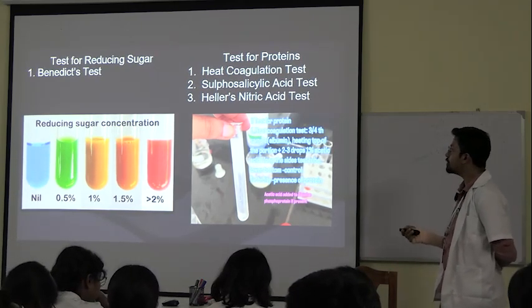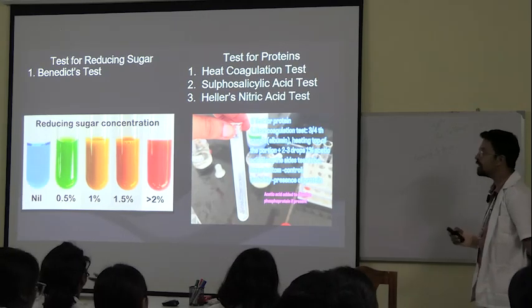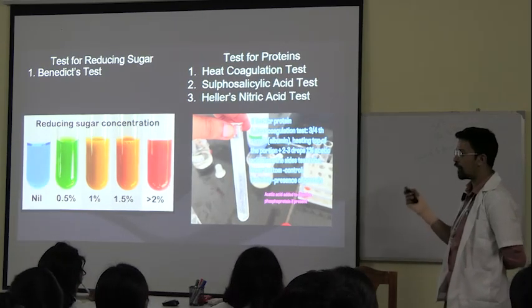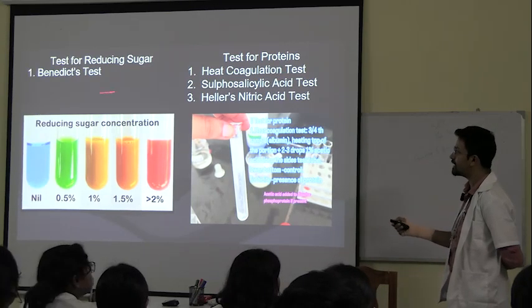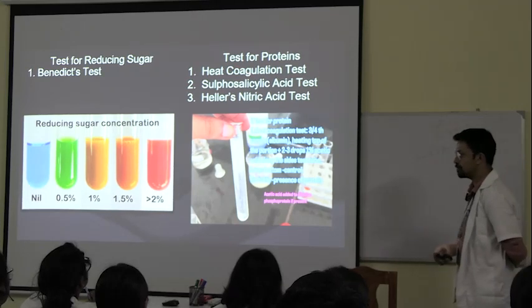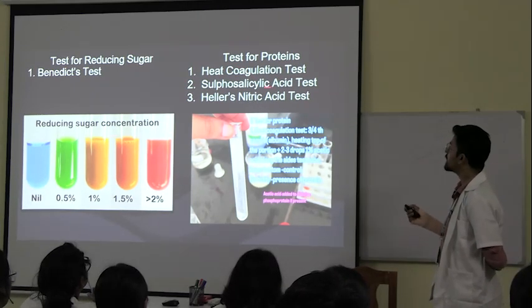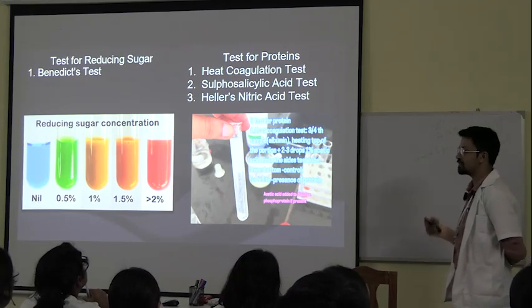Fine? I'll explain you. But these slides, these photos are just so you get some idea what the next topics will be and how they will look. Like over here, see, the test for reducing sugar is Benedict test. I'll be discussing only this much. Fine. The next topic will be test for proteins, which will be in the subsequent classes. We'll be doing heat coagulation test in your lab. But the rest of the two things can be asked in your viva.